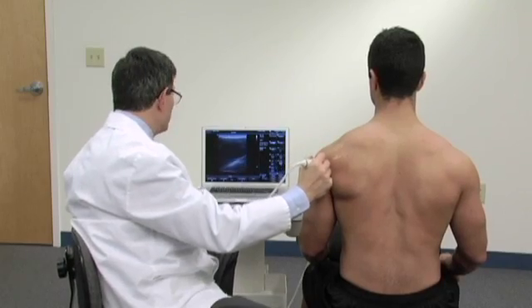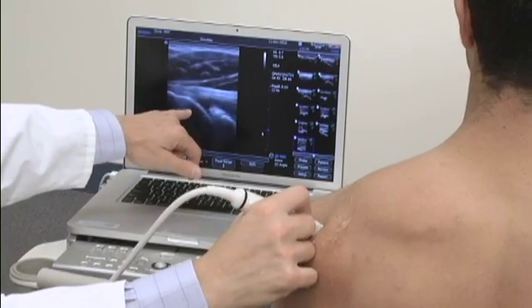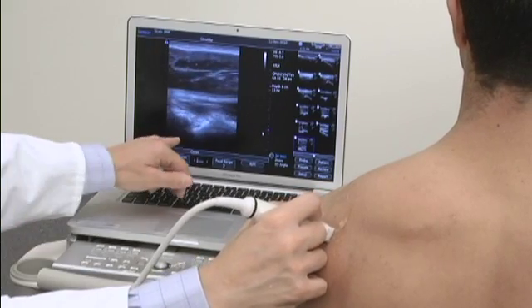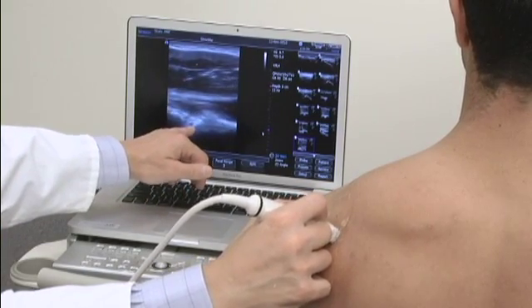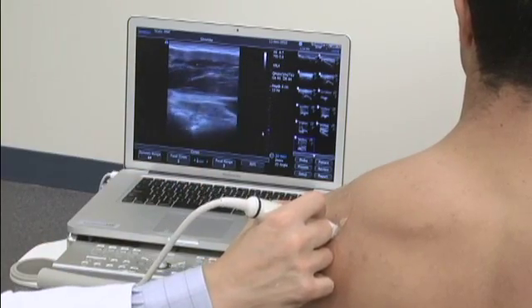When we're in the position looking at the posterior glenohumeral joint and we see the infraspinatus, we should always slide medially to this region, because right here is the spinoglenoid notch where we frequently will find paralabral cysts.